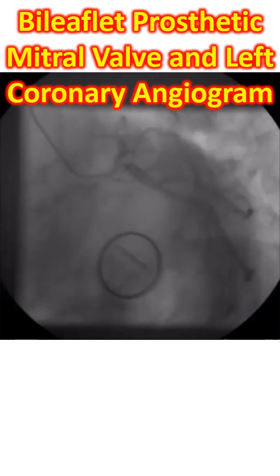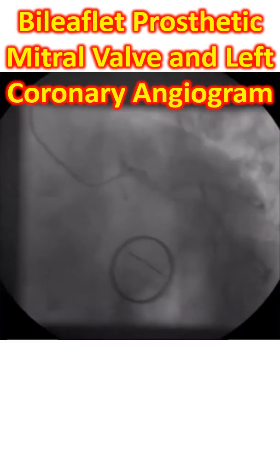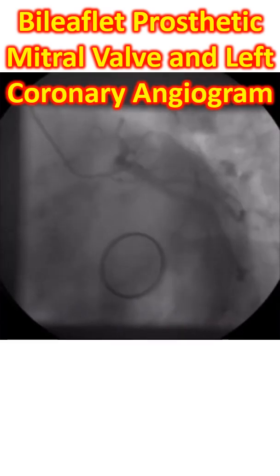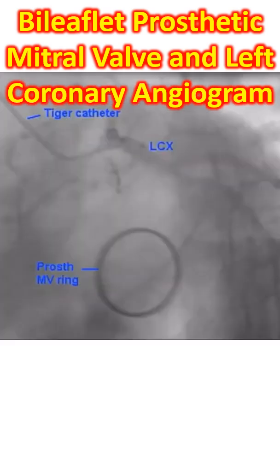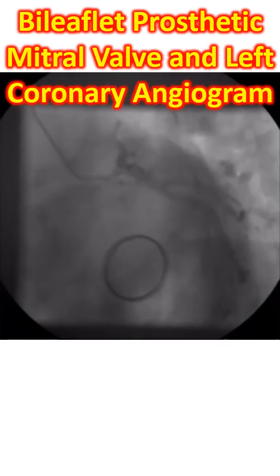The image shows the opening and closing of the mitral leaflets. This is the ring of the prosthetic mitral valve. The leaflets are seen opening and closing, and two leaflets are seen in this view.